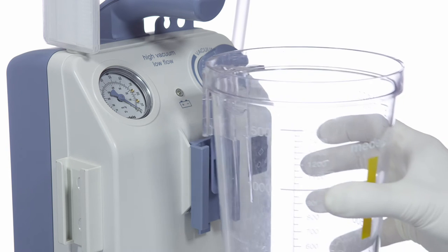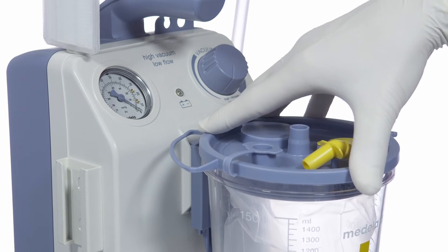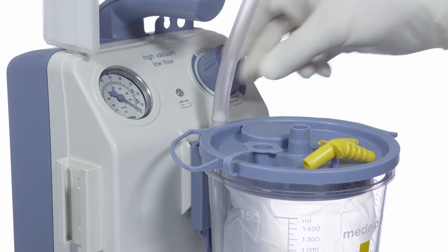Insert the 1.5 litre polycarbonate suction jar. Insert the 1.5 litre liner and press the lid down firmly. Connect the tubing from the filter to the vacuum port on the jar.